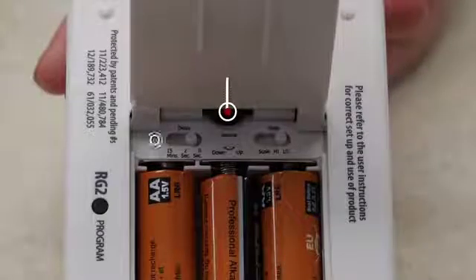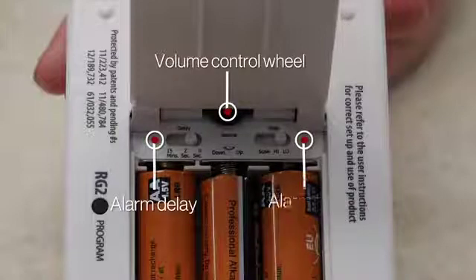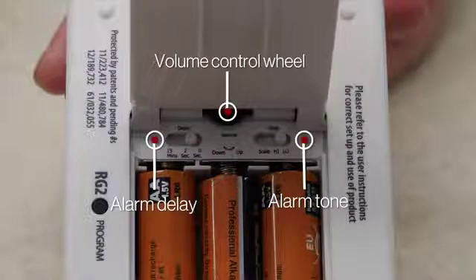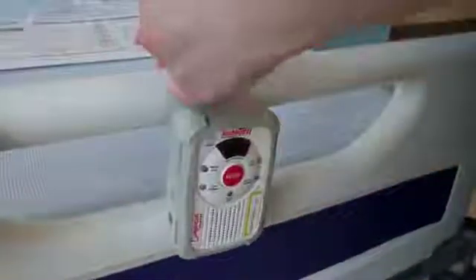The volume control wheel, alarm delay, and alarm tone settings are located inside the battery cover. The default is set to volume low, tone 1, and delay 0. The companion also comes with a wipeable vinyl hanging strap for easy mounting on a bed or chair.